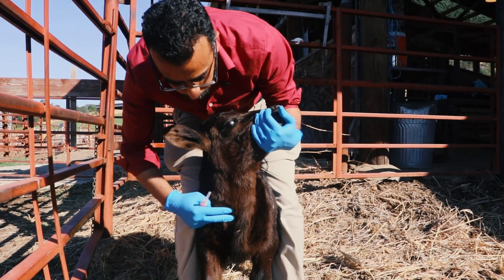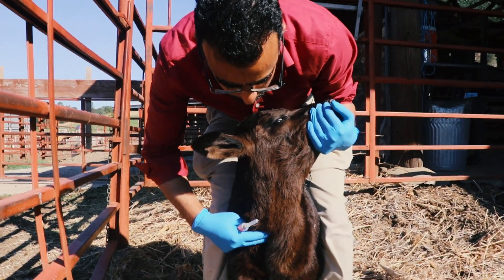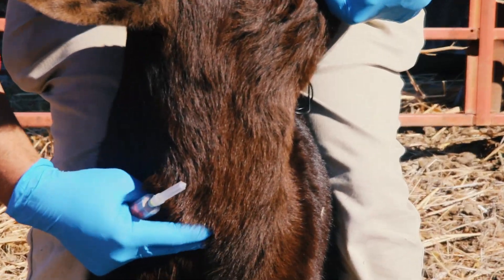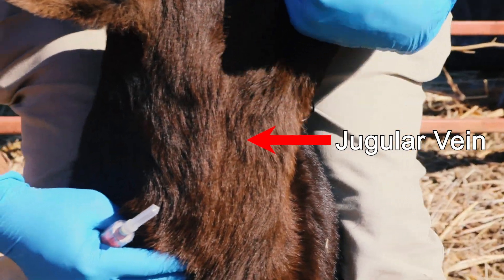If you want to take blood from a calf — for example, to check whether it has consumed enough colostrum — it is very important that you have really good restraint. To visualize where to insert the needle, hold off blood flow by pressing your fingers into the jugular groove and the jugular vein will become visible.